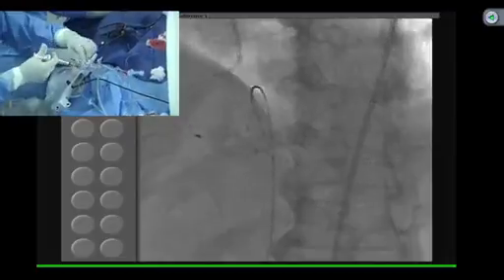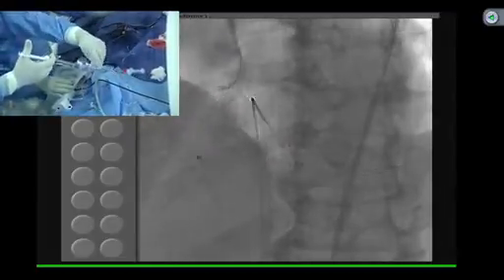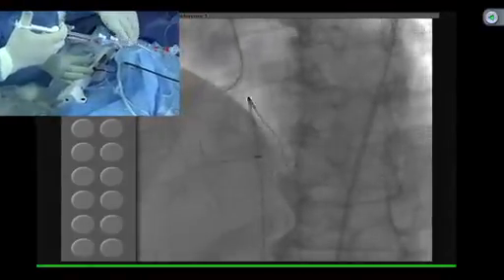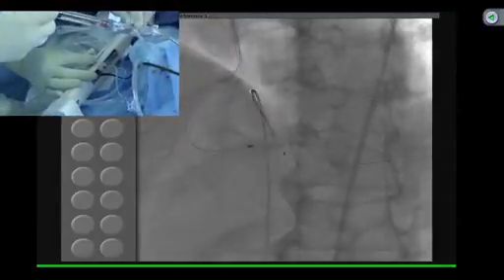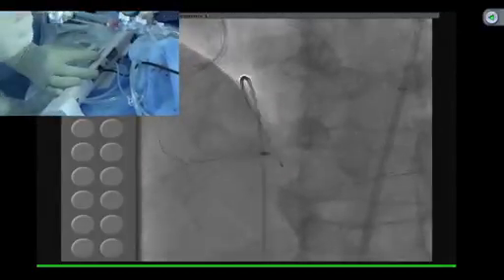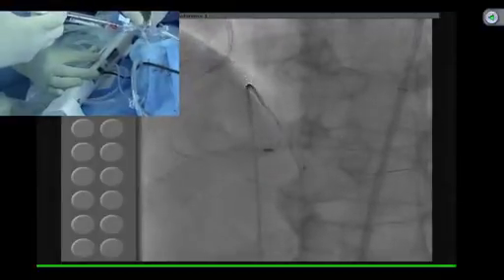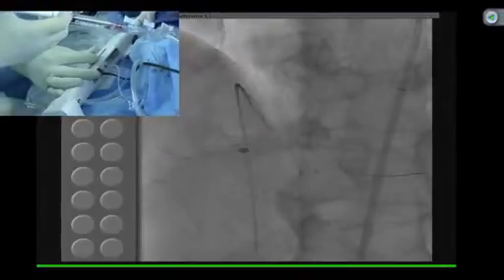Good. Okay. Come off Dyna and start rota again. At this time you don't have to do the 3 steps again. So here, this is where we know we may always have trouble. You have to make sure you are doing nice rotational atherectomy and try not to push the burr, because this is the place where you may have burr entrapment.